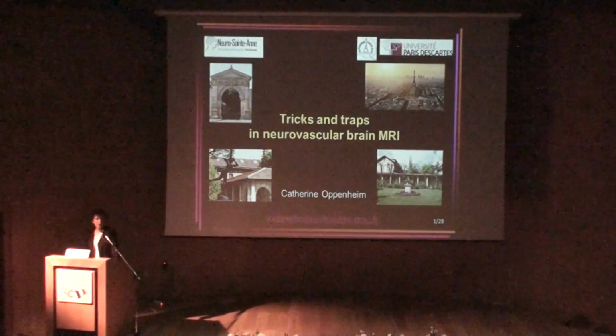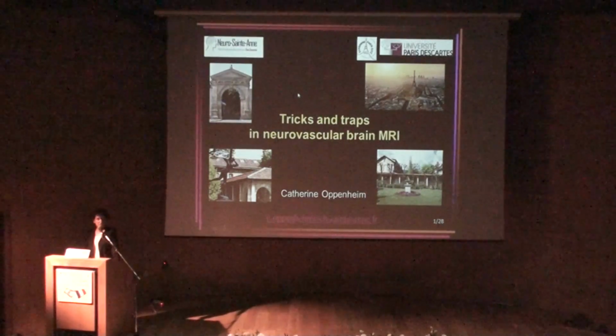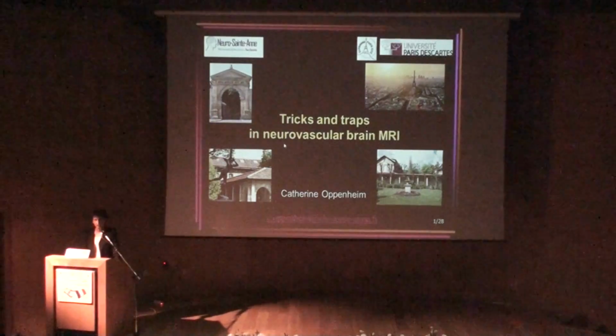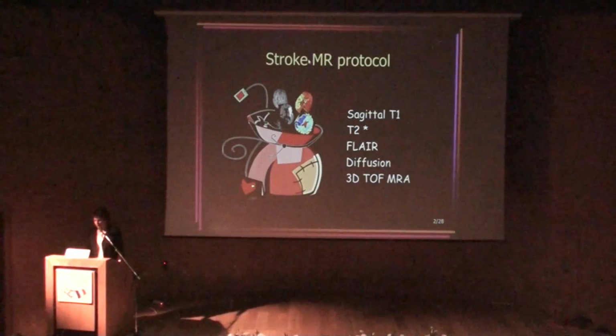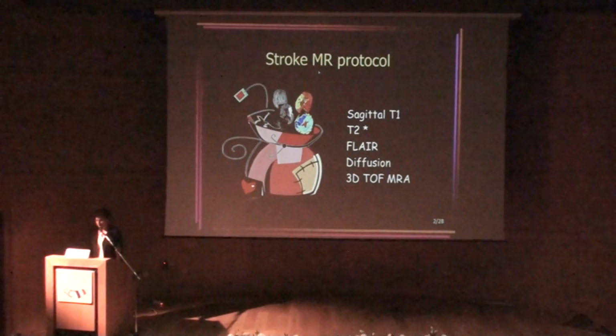Now I think your brain has worked a lot listening to Damien, so I propose that you relax and I hope you will get a few tricks for your daily practice from my talk that will be focused on neurovascular brain MR. I propose to organize my talk as following.